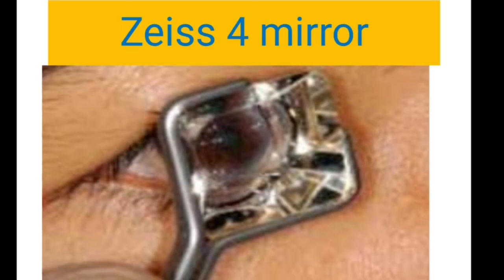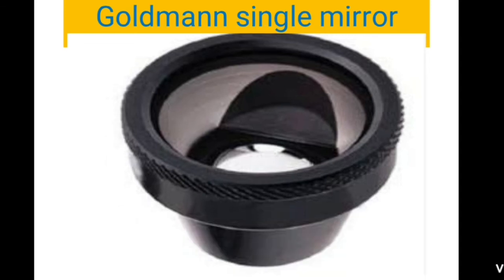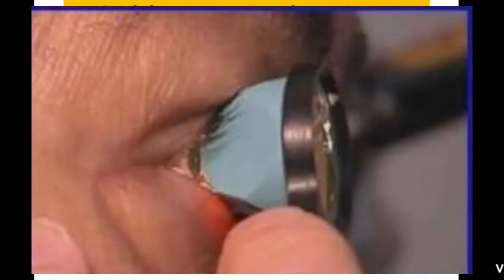Coming to the procedure of indirect gonioscopy. Now you know the various types of indirect gonioscopes. First I will explain about the Goldmann lens. First you anesthetize the patient's cornea with topical anesthesia. Make the patient sit at the slit lamp. As I told, there is a gap between the posterior surface of the lens and the cornea. So you have to fill the posterior part of the lens with balanced salt solution or viscoelastic material, and then gently retract the lower eyelid and place the goniolens over the cornea.